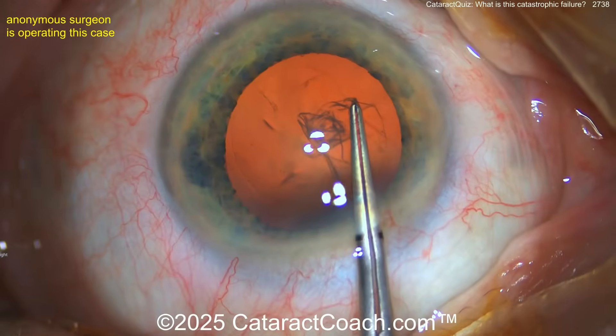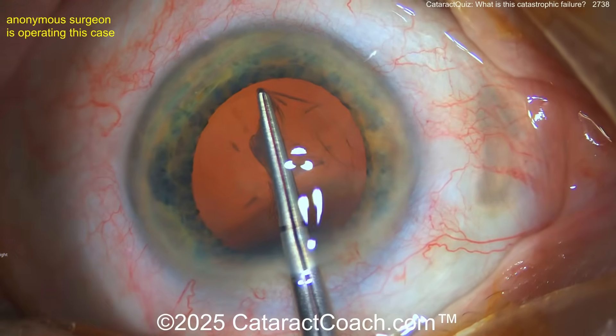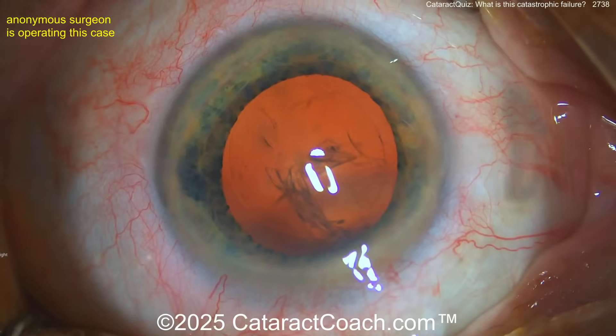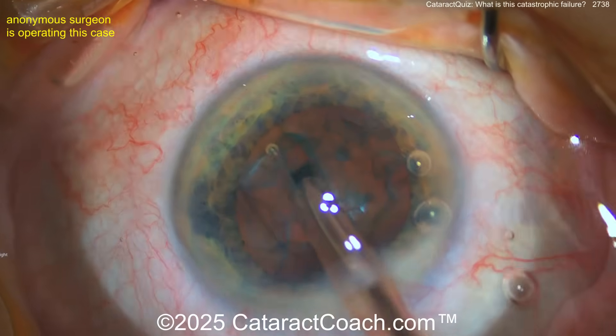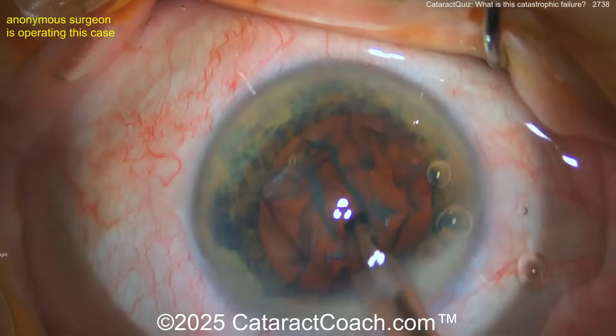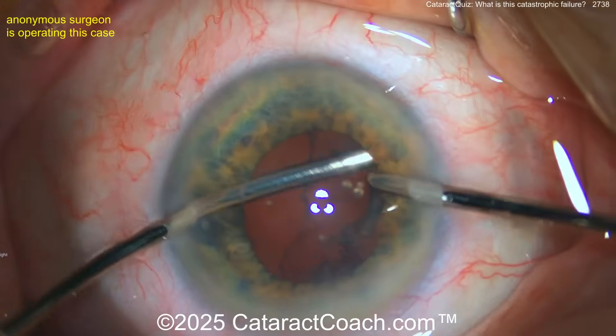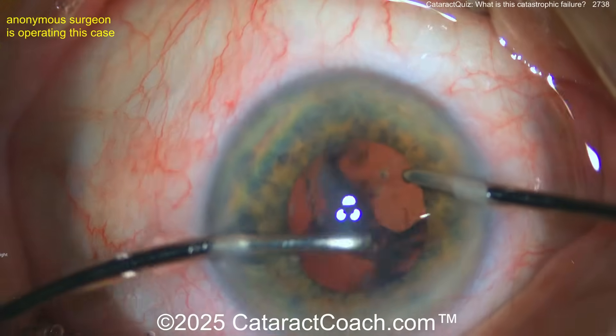Here comes the rhexis — the rhexis looks pretty good, no issues at all so far. This is an experienced surgeon, not a new surgeon. Now phaco time: a little groove down the middle, maybe a stop-and-chop technique. The phaco goes pretty beautifully, nice and easy, smooth splitting.